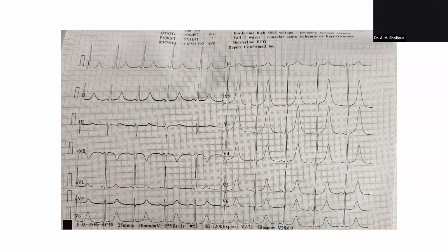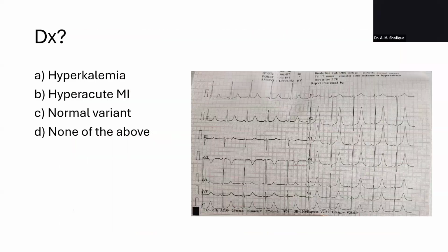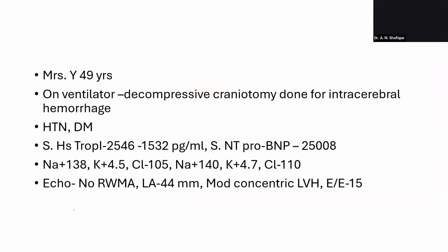They sent me 2 more ECGs where there was no ST elevation, where the T wave is going down. So we can move to the next ECG, sir.